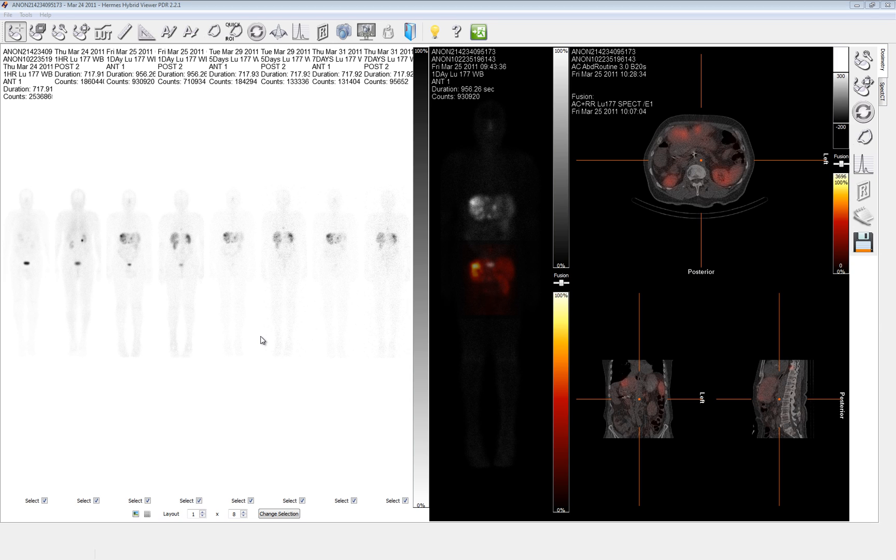Here we have Hybrid Dose loaded with four whole body images acquired at one hour, one day, five days, and seven days after injection. Each time point has both anterior and posterior views. Also loaded is a SPECT CT that was imaged minutes after the completion of the one day whole body. The isotope used in this particular example is Lutetium-177.